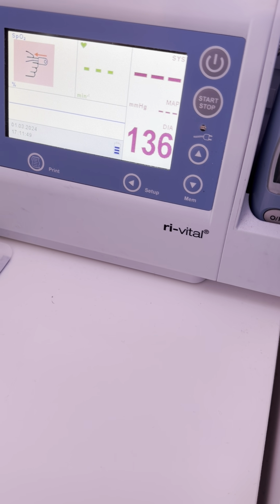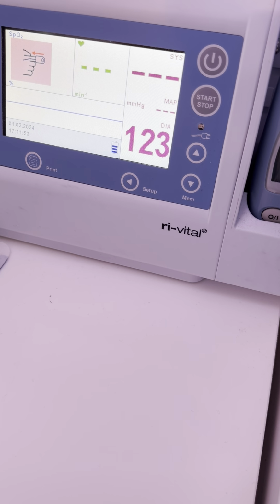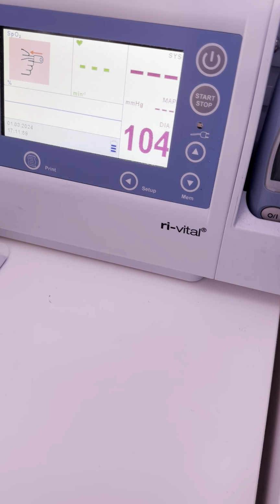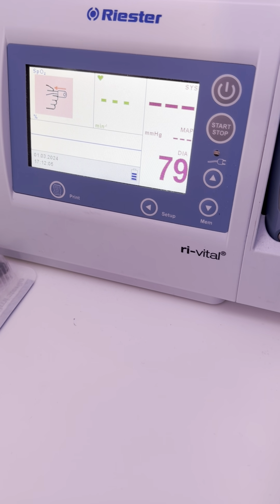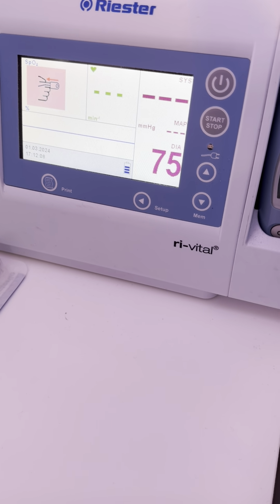Unfortunately, like I said, I can't do it live, which is horrible because I really wanted to do a live. It would have been so much nicer, but this is an emergency. Hurry up, machine, please. I've sterilised all the kit, I've got it ready, and I'm ready to go straight in for this change.